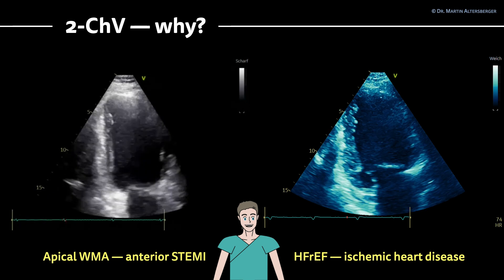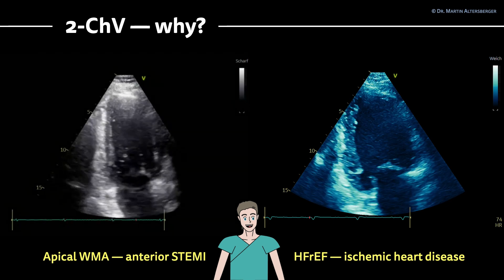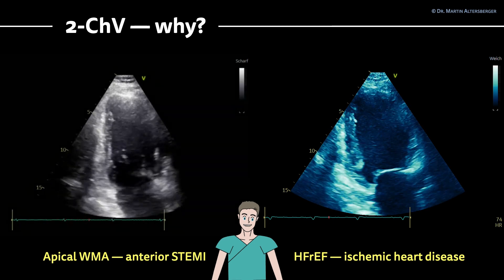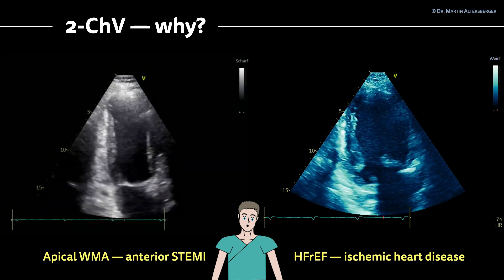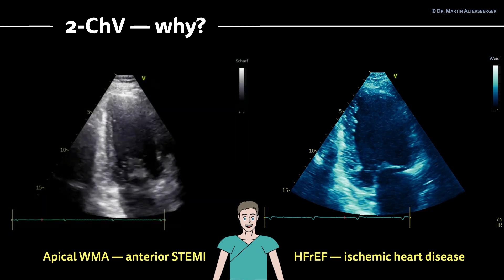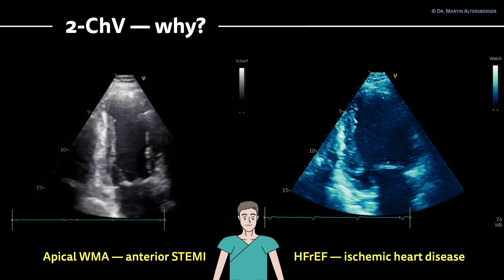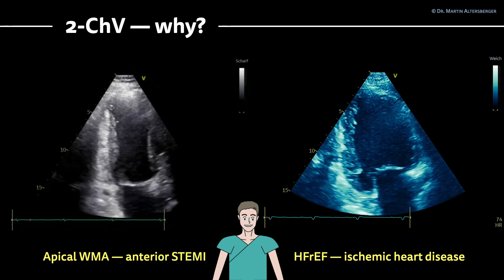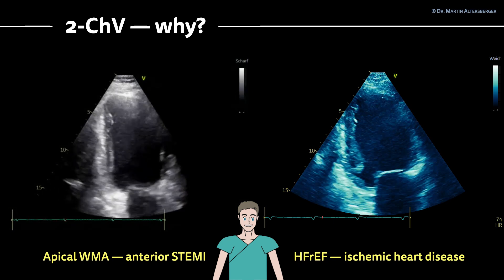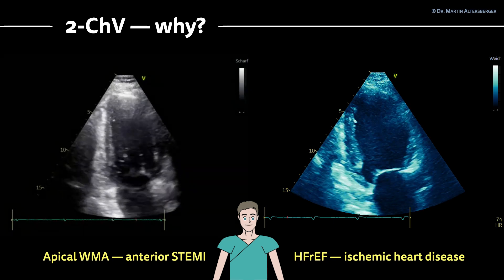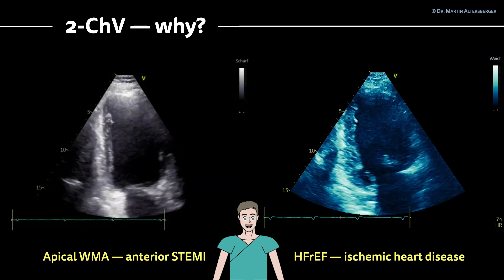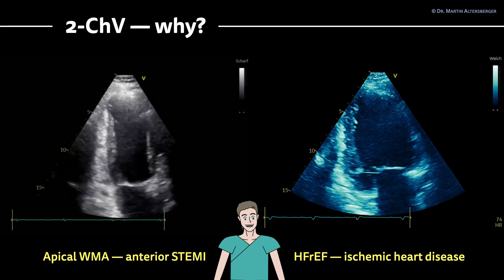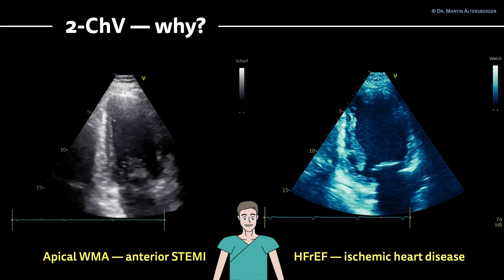Here we have two examples, two patients. We have an apical wall motion abnormality in an anterior STEMI — an anterior ST elevation myocardial infarction — and on the right-hand side we have a HFrEF, heart failure with reduced ejection fraction in ischemic heart disease, where you can see the truly severely reduced left ventricular function.